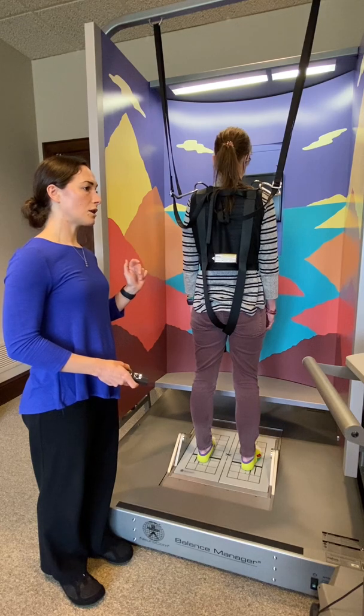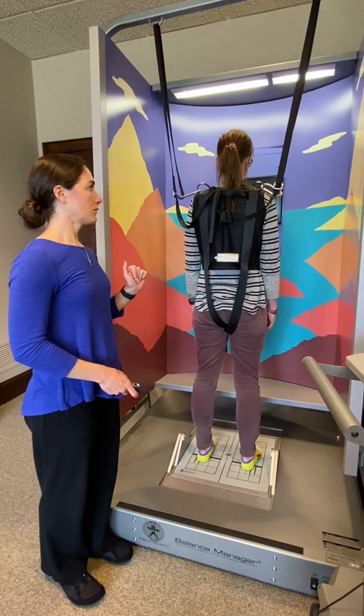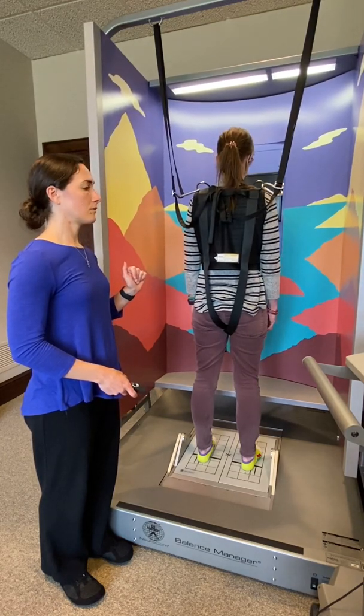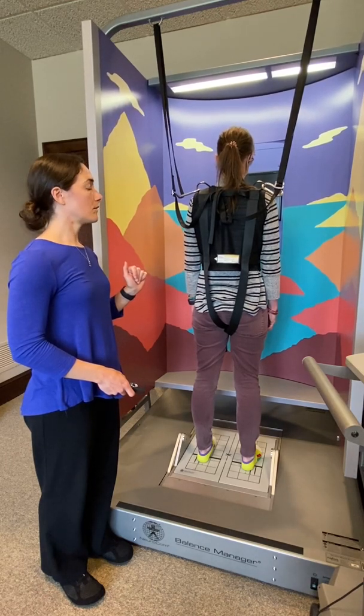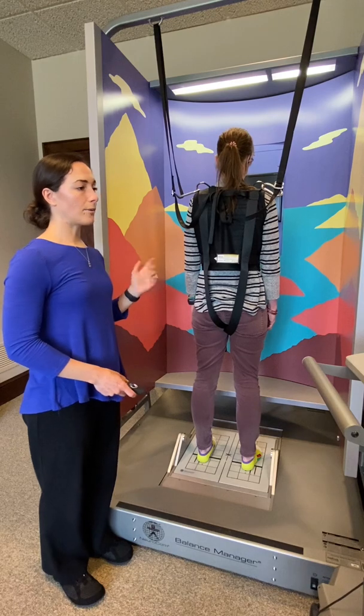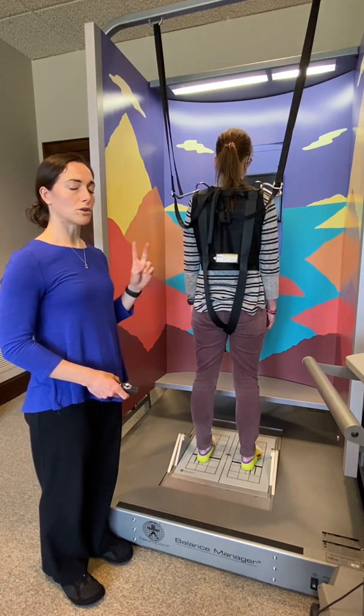So Jill, this is condition three — eyes open, the walls might move. I'll begin the test starting now. I'll stop the test. Normally that would go on for another 10 seconds, and then we would do that same condition twice.